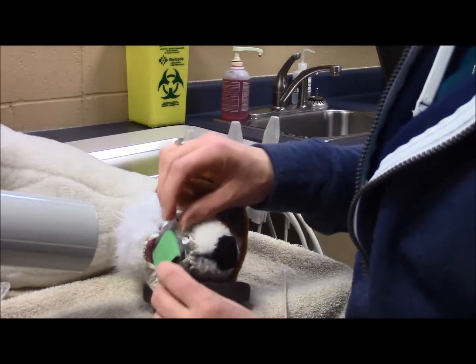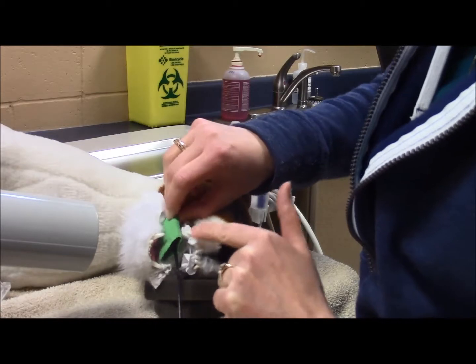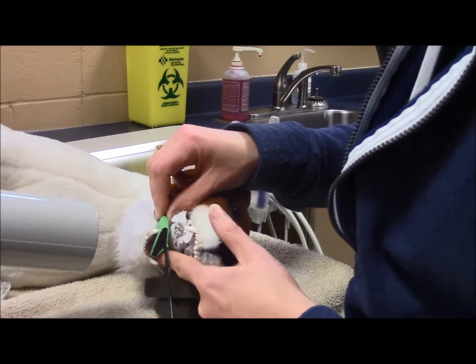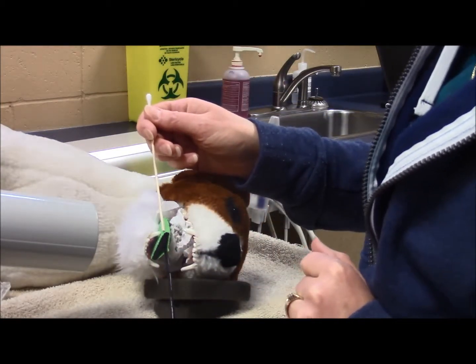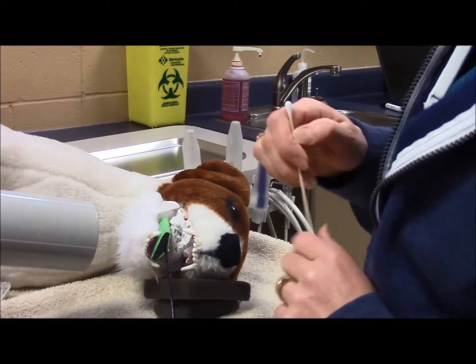Film sensor placement for this one, you're going to take the crown of the mandibular canine and just have it in the upper corner of the sensor. Use your paper towel to keep it in place. Make sure that the crown of the canine tooth isn't too close to the perimeter because you do have that inactive area on your sensor.